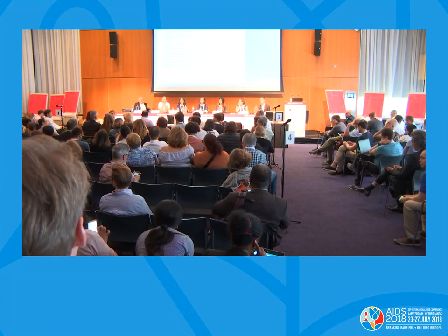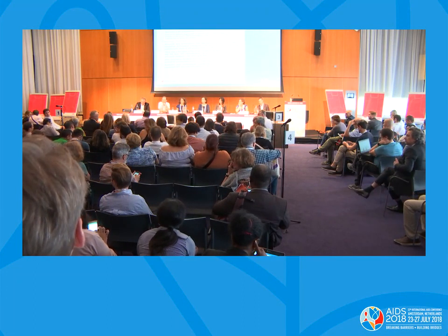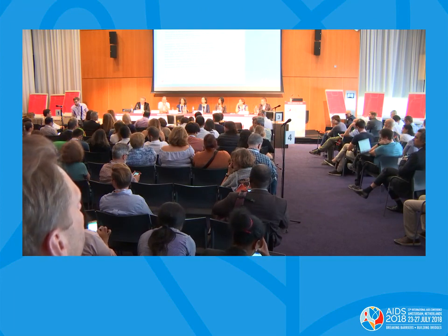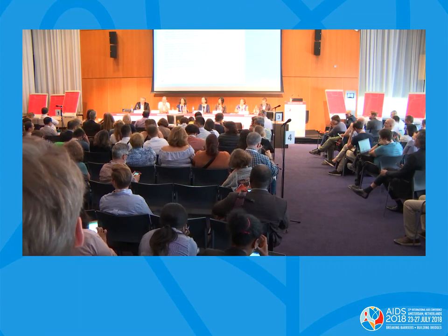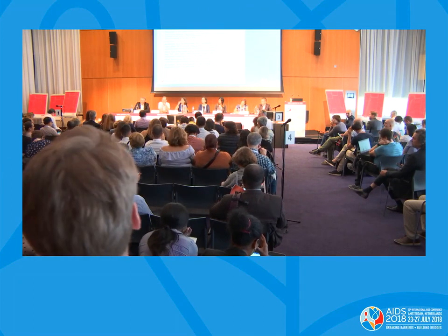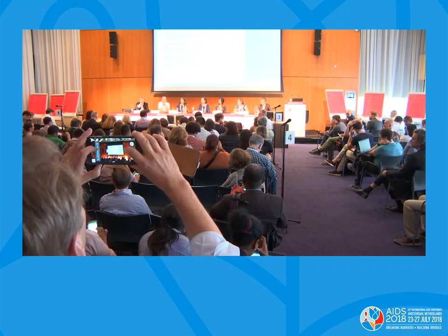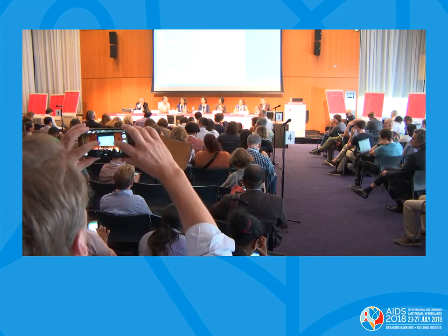Jim Braun from PRN in New York City. Two questions, one to Erin Srila-Orr, and then second question to the whole panel. The Determine test does seem to function well as a rapid test detecting antigen in plasma, but it doesn't seem to perform so well for whole blood. And since it was designed as a point-of-care rapid test, I'm just wondering whether you are doing any kind of comparative study to see whether you can use whole blood from finger sticks in point-of-care service and whether this will compare to plasma results.